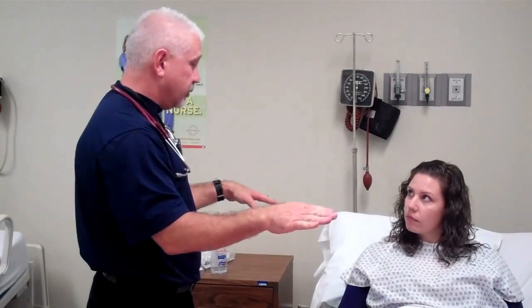The other thing I need to make sure you realize is that while you're wearing oxygen, you cannot smoke. No smoking whatsoever. And the hand lotions or facial lotions that you use, make sure you check with the nurse first before using them. And I would like you to limit your electronic device usage while wearing oxygen. The reason is that anything that could burn in room air will burn hotter and faster in the presence of pure oxygen, and that's what I'm giving you. Okay? Do you understand what I'm saying?